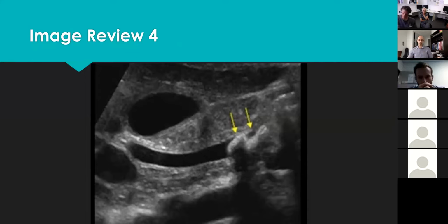Can I ask one more question? Because it's maybe a very basic question. Sometimes I really struggle to find the CBD. So what are your tips and tricks to find the CBD?